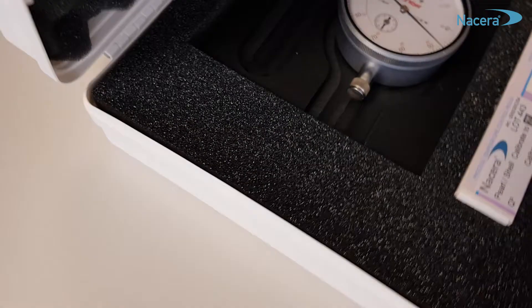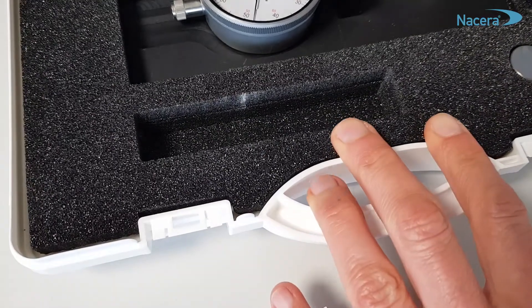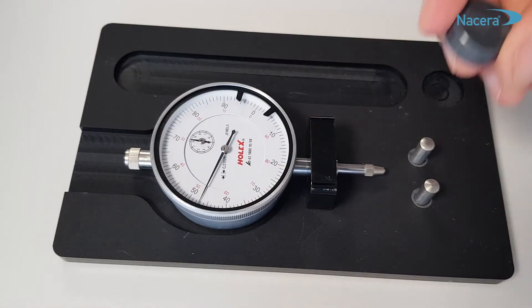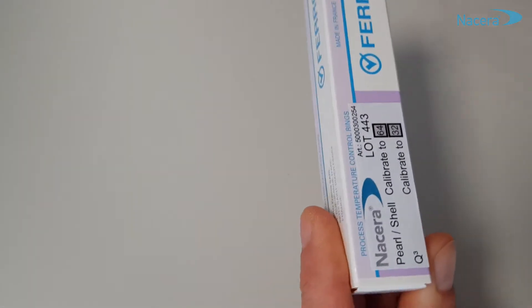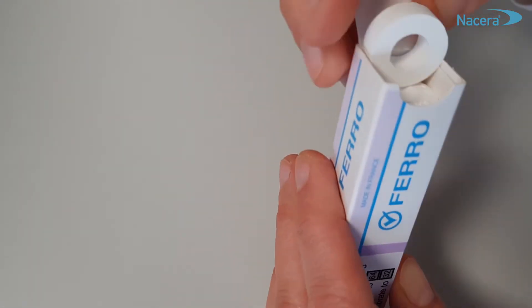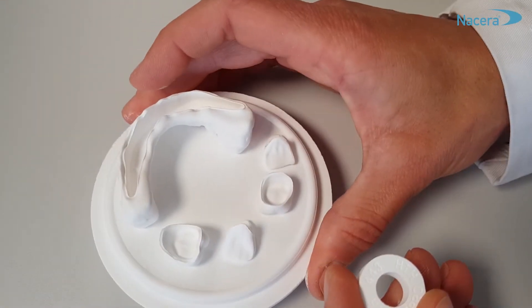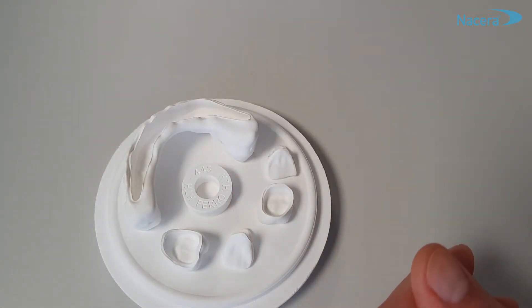First, unpack all parts from the Calibrate case. Take one ceramic ring from the delivered packaging. Place this ring on your sintering tray between the restorations to be sintered. Start the sintering program as used.